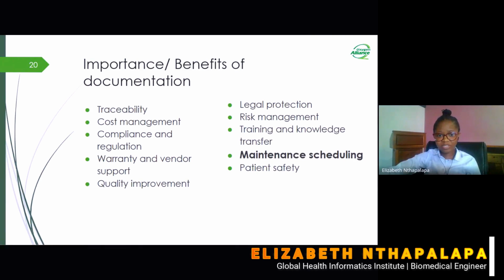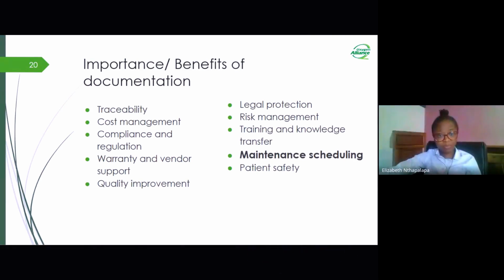Last but not least, we have another importance of documentation, whereby we have the help of maintenance scheduling. Well-documented schedules ensure that equipment is serviced regularly. So we are able to know that this machine was worked on such a date, and after this much time, we need to schedule another maintenance time. It just helps us to understand when we need to do the maintenance again.